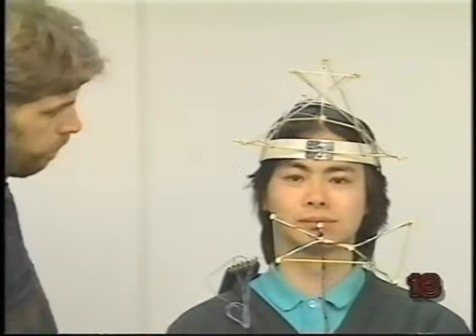The system must compute 2 coordinate transformations in order to specify jaw motion in its own frame of reference. Starting at the lower left of the figure, the first transform is from the world view of the optotrak to that of the head. This transform is necessary for basic head movement correction.